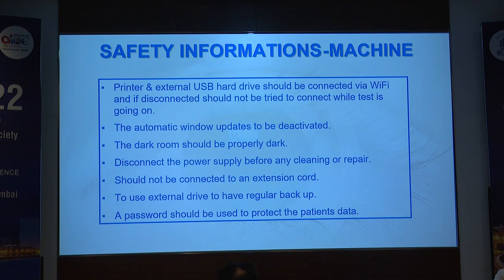Safety information regarding the machine. If you are using a printer or external USB hard drive, it should be connected to a Wi-Fi. Automatic Windows updates should be deactivated. The dark room should be properly dark. Disconnect the power supply before any cleaning. It should not be connected to an extension cord. The external drive should have a regular backup, and a password should be used to protect patient data.